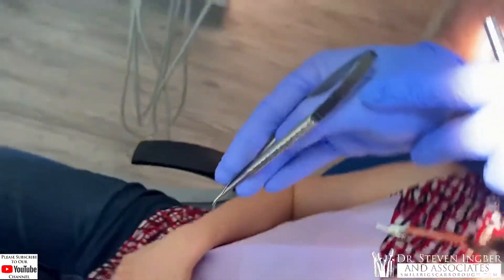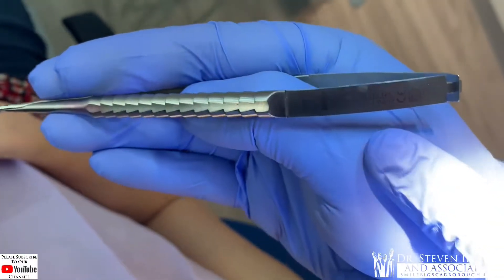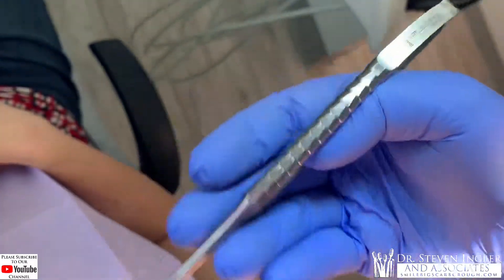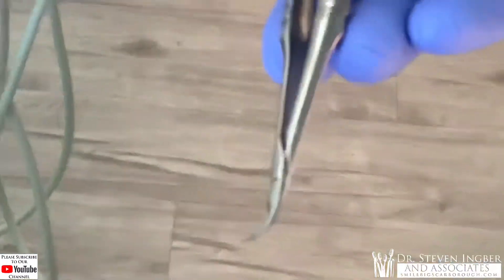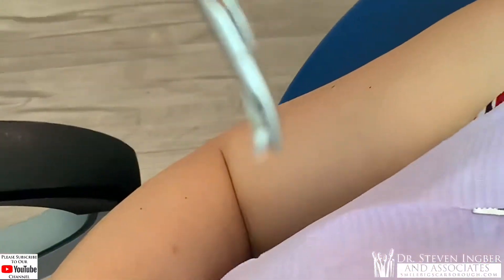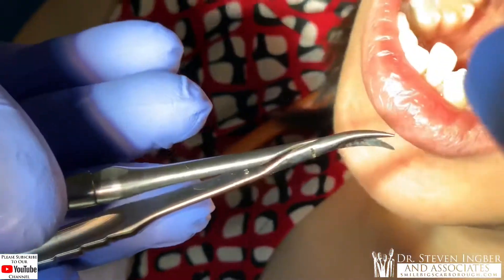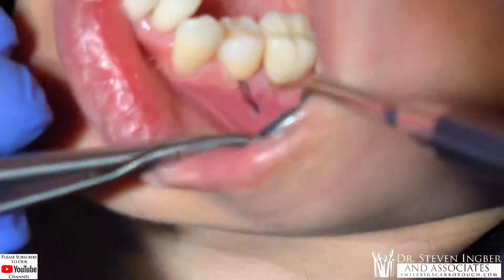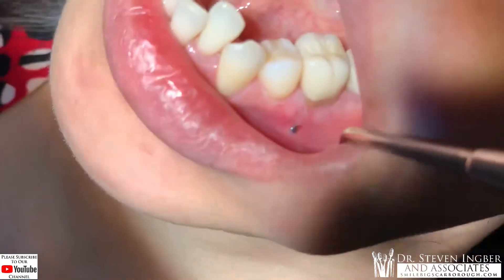This is the Zeth — my latest acquisition and I'm very proud of it. This thing is a work of art. I don't know how the Germans do it. Here's a little tip: see the little side here — you go underneath the stitch, just catch in the center and go click. As long as you hear that click, you've cut the suture. So we just cut one. No injections here, no pain here.